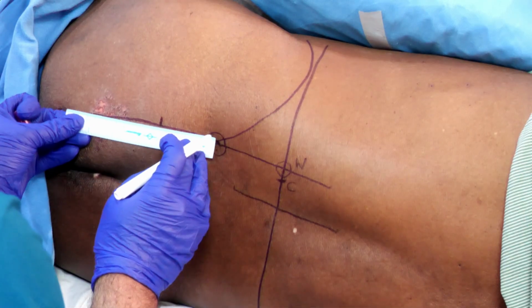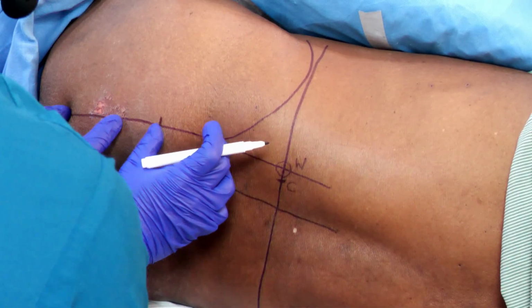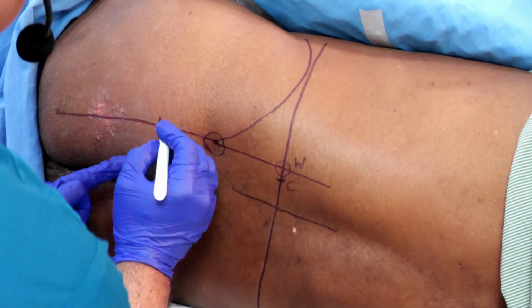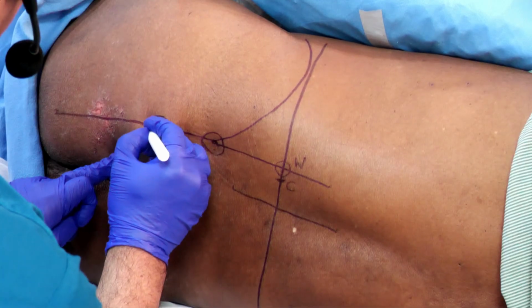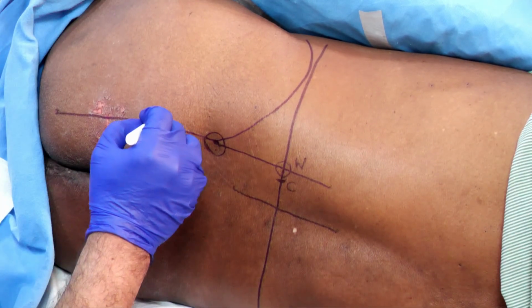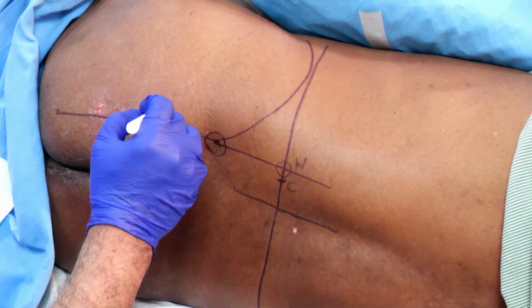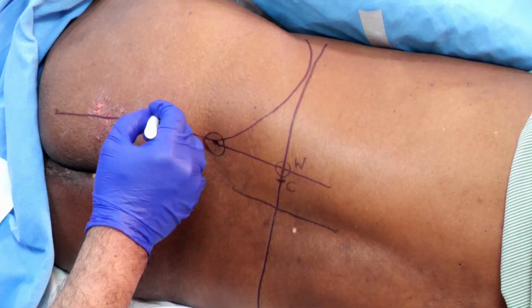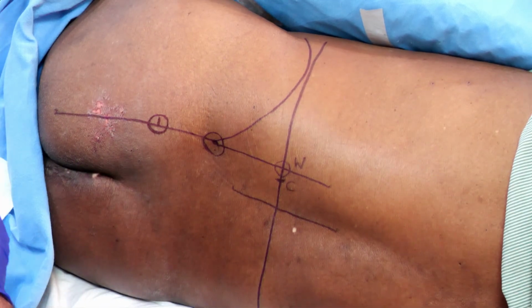And if it is divided into 3 parts, it would be almost very close to that. So this would be 6 centimeters caudal to the posterior superior iliac spine. That's the anatomical landmark. Through the skin, subcutis and gluteal muscles, you get the contractions. It might hit the iliac bone, and then you have to deviate your needle to go beyond that into the greater sciatic notch to get hold of the sacral plexus.